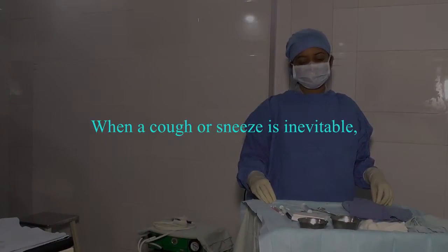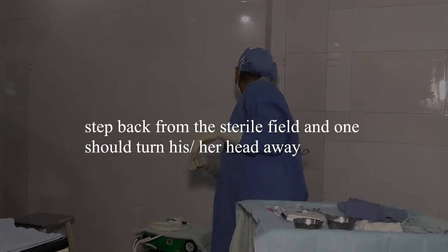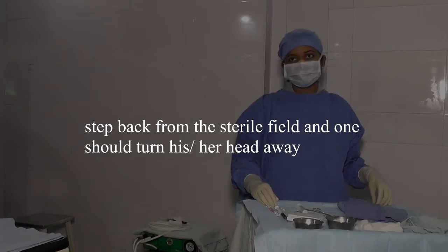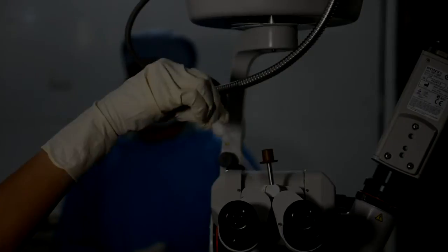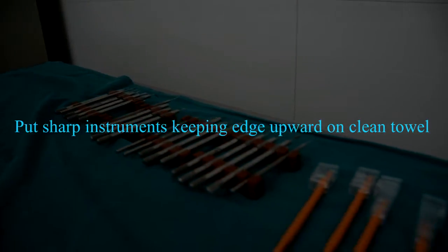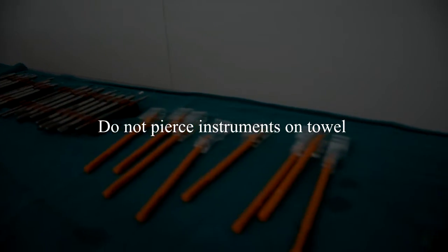When a cough or sneeze is inevitable, step back from the sterile field and one should turn his or her head away. Surgeon should not touch the unsterile portion of the microscope. Put sharp instruments keeping the edge upward on a clean towel. Do not pierce instruments on the towel.